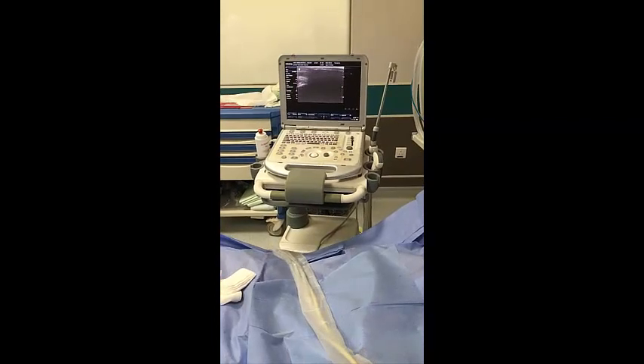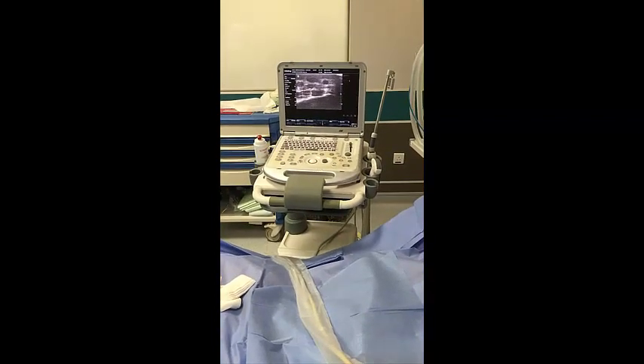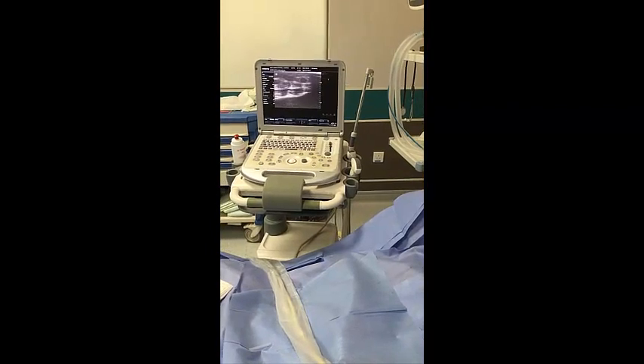You can see here — this is the radial artery. You see the radial artery with normal settings, in the proper way.